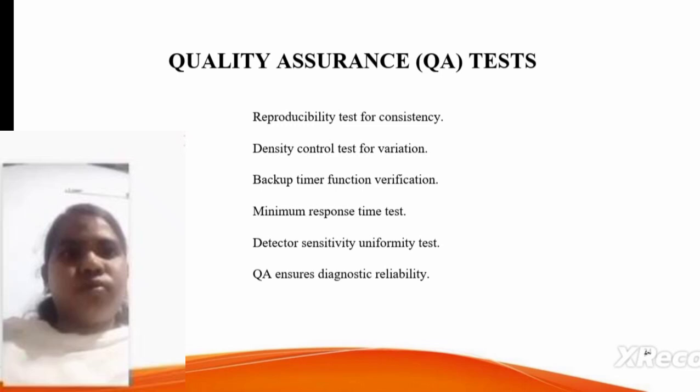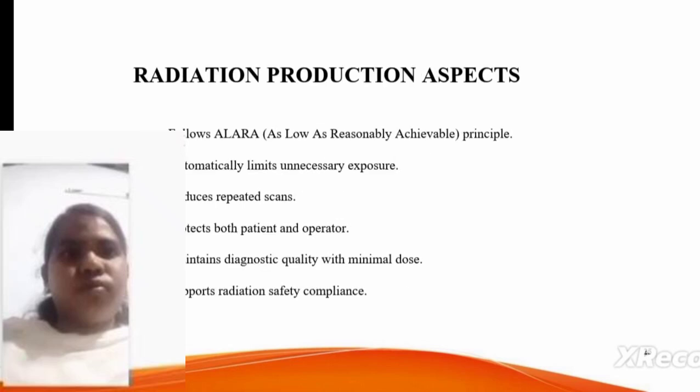Quality assurance tests: reproducibility test for consistency, density control test for variations, backup timer function verification, and minimum exposure response time test.